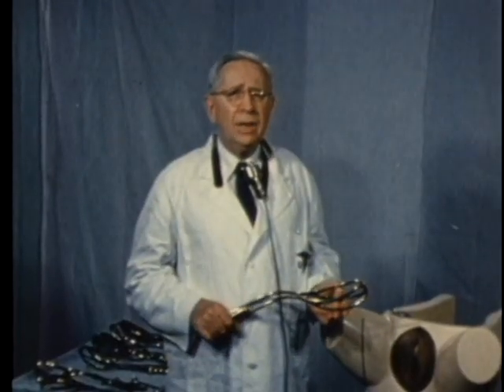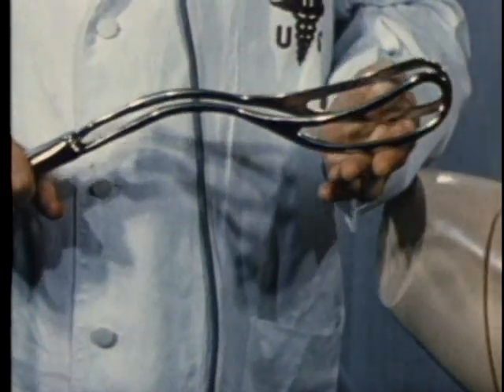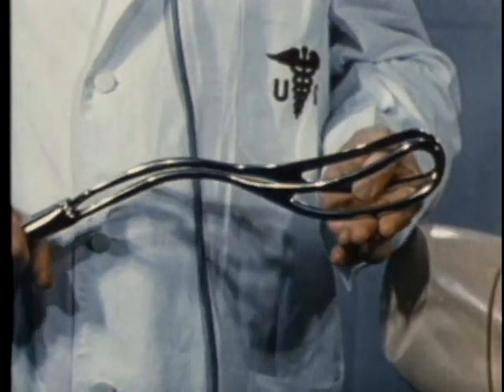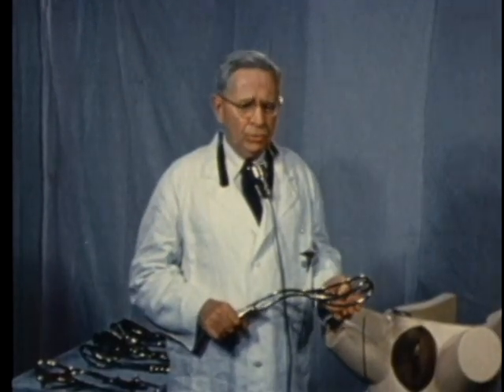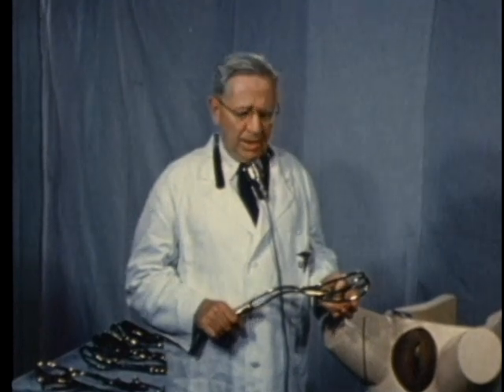Thank you, Colonel Reva. In 1924, the late Edmund B. Piper of Philadelphia presented this instrument, which is intended for the aftercoming head, and is not to be confused with his other instrument, the two-piece axis traction forceps intended for the forecoming head.